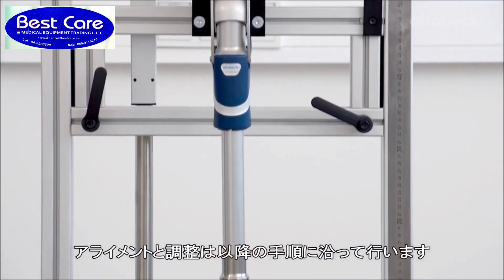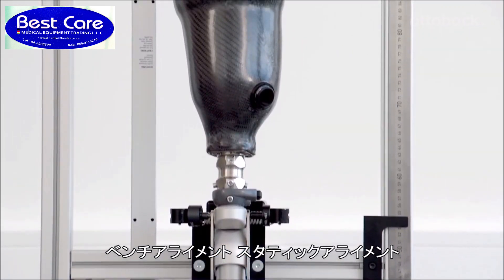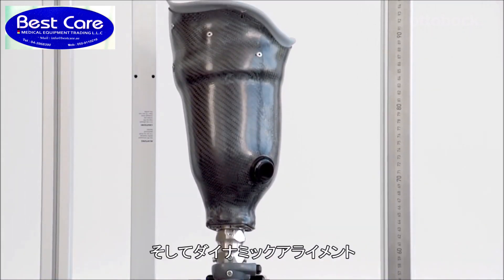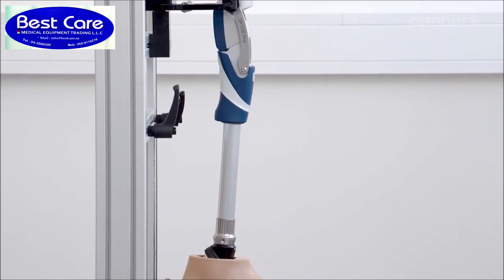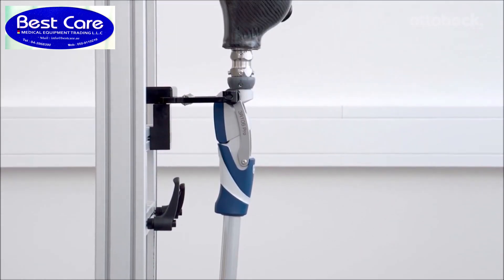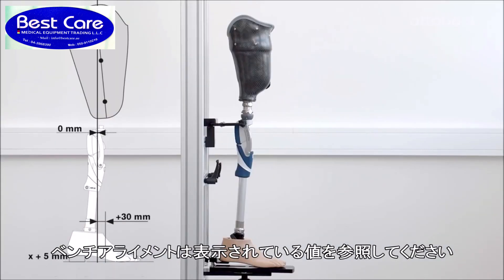The alignment and adjustments are easily completed in the following steps: bench alignment, static alignment, and dynamic trial fitting. Please refer to the displayed table for the correct bench alignment values.